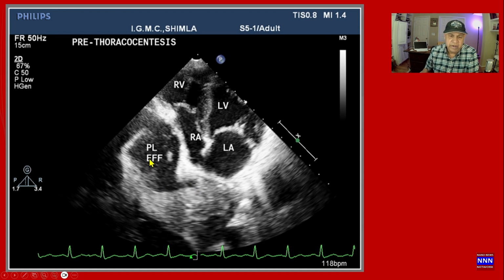It's important to realize that pleural effusion can compress the right atrium just like pericardial effusion, but generally, if you see a compression of the right atrium with no evidence of fluid in the pericardial space in other regions of the heart, you're not dealing with a large cardiac effusion or a tamponade.